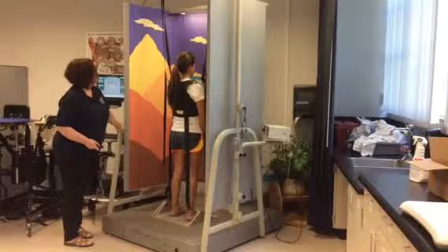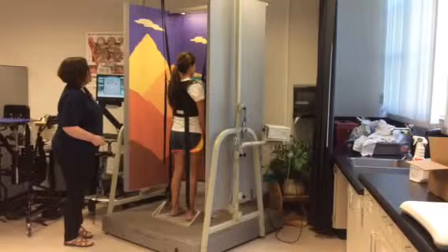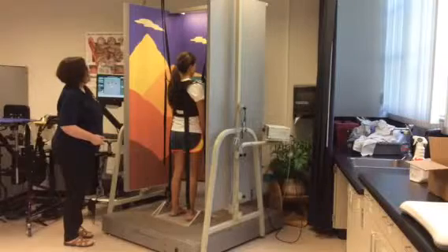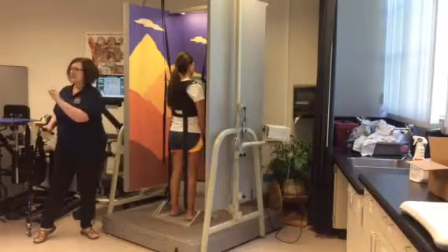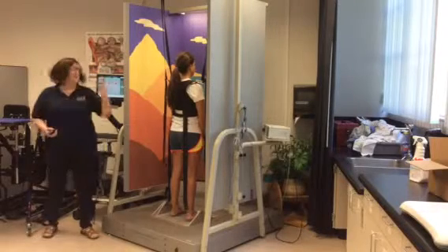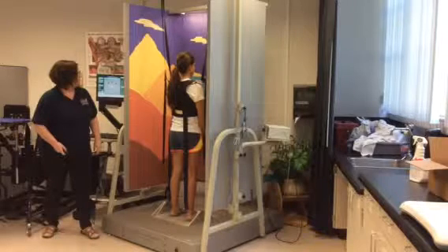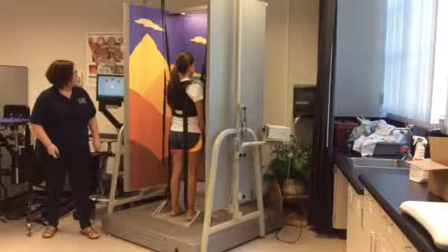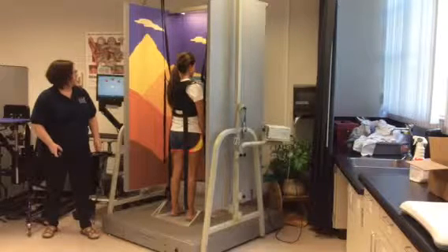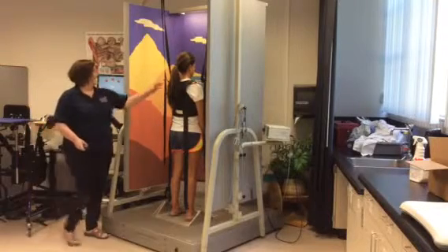So let's take a look at what that means. I'm going to set it variable, and I'm going to set it at 60% difficulty, okay? Just so you can get a sense. So I'm going to work her vestibular system at 60% difficulty. How easy is this to document? All right, so 60% of her sway. Watch what happens. Erica, your job is to get in the middle, okay? And when I start, I want you to shift your weight toward the target that is yellow, okay?